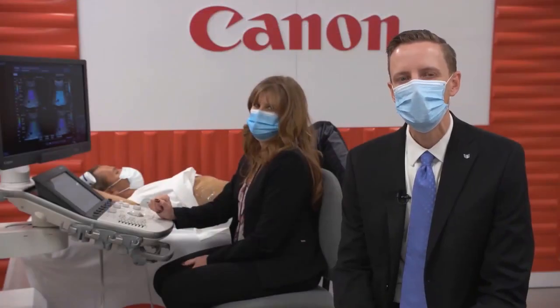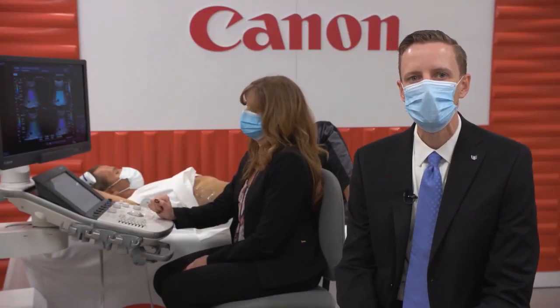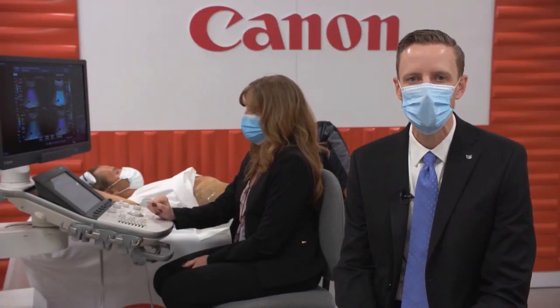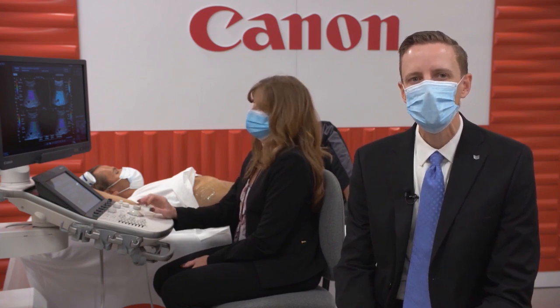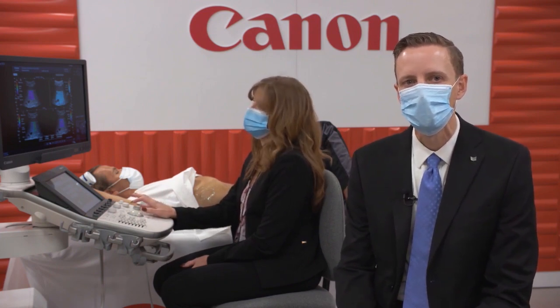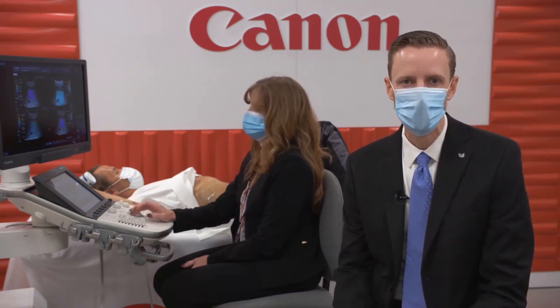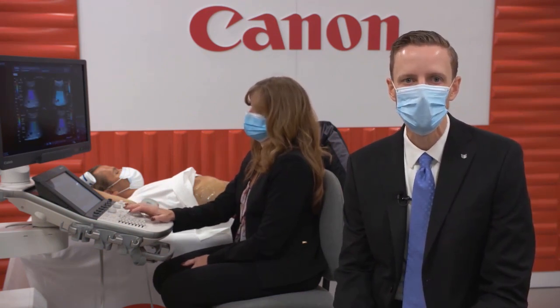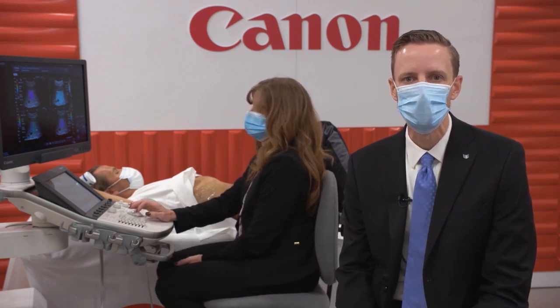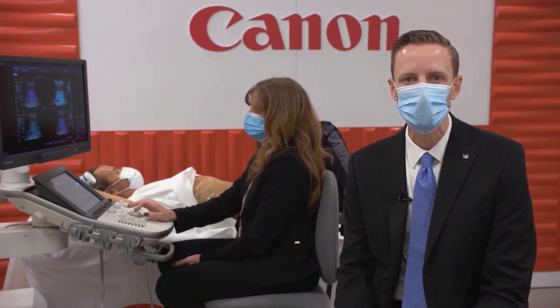What do the colors mean in the shear wave propagation map? The colors indicate the propagation direction. Using the default color map, blues indicate early arrival times and reds indicate the later arrival times. That can help when you're assessing the shear wave quality using the propagation map display.